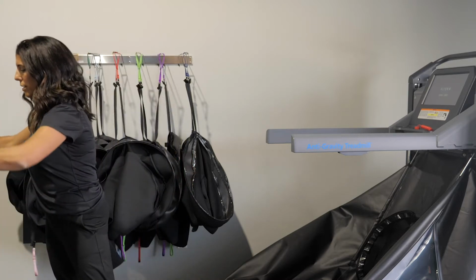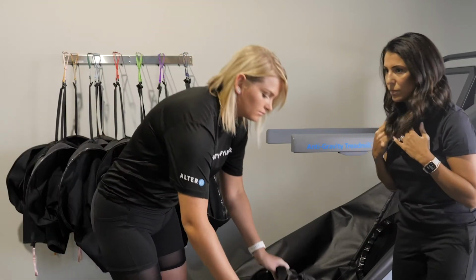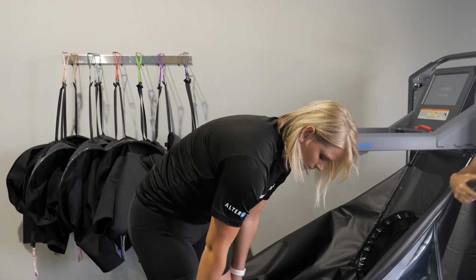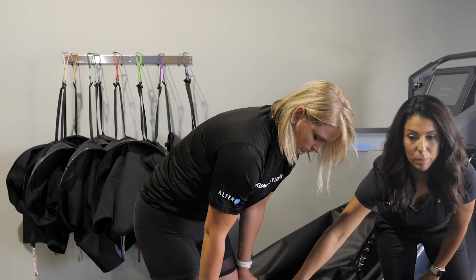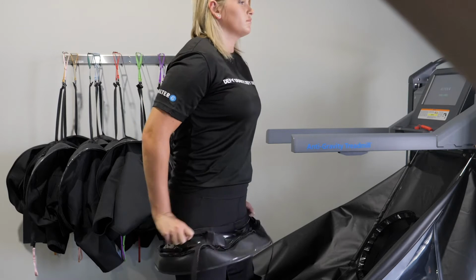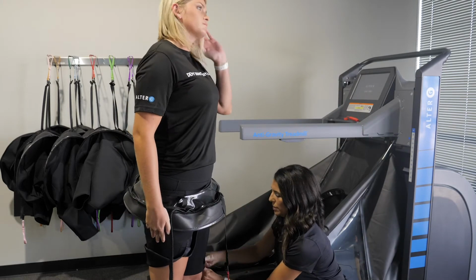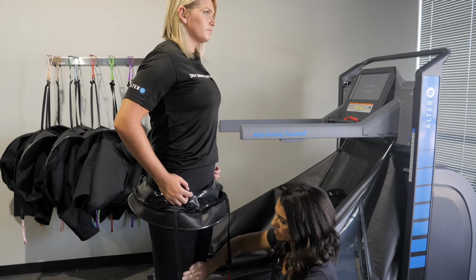So we'll go ahead and put these on. So you can come over here. It's important when you're putting on the shorts that we're pulling from inside and not from this neoprene ring. So this can easily be punctured, so it's important that we pull from the inside. And then we're going to simply secure the Velcro to create the airtight seal.